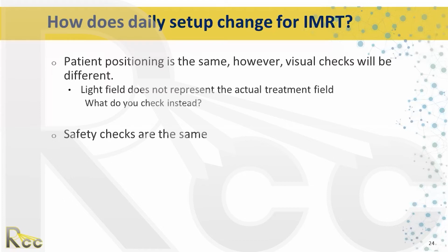So you want to line up to your CT references and make the appropriate shifts and verify that you've made these appropriate shifts by thinking, well, what am I treating? Does this make sense? So if you shifted 7 superior and it says T7, are you in the T7 range? You want to make sure that that looks correct. And also a lot of times we will mark the ISO center.